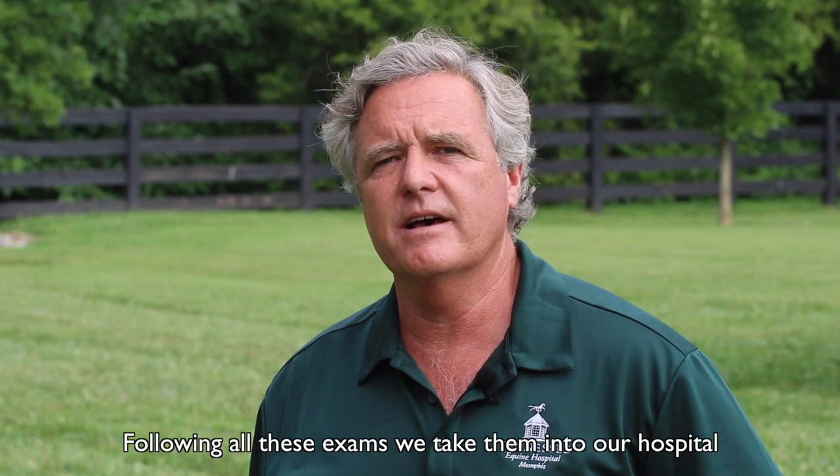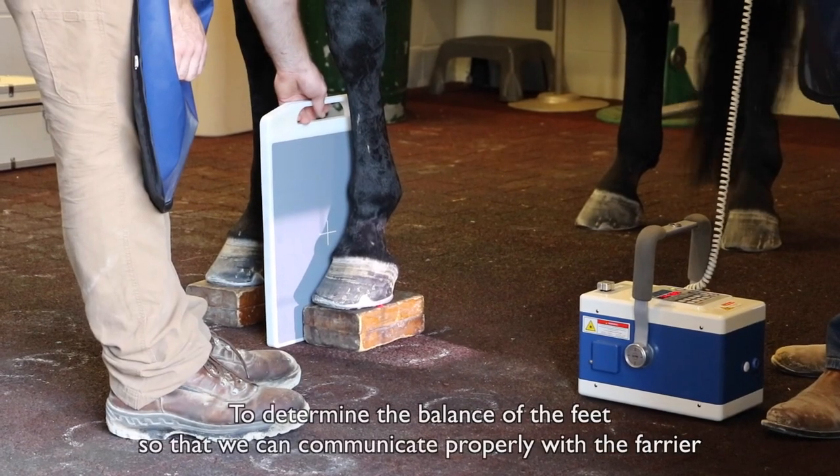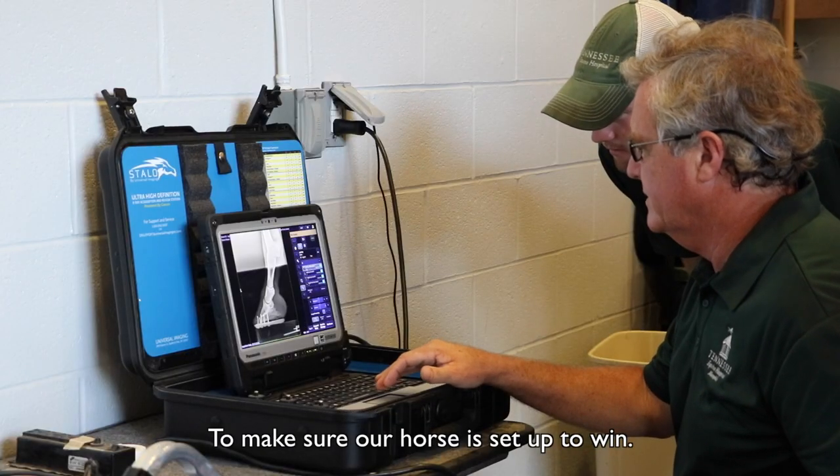Following all these exams, we take them into our hospital and we do a radiographic evaluation of the front feet to determine the balance of the feet, so that we can communicate properly with the farrier to make sure our horse is set up to win.